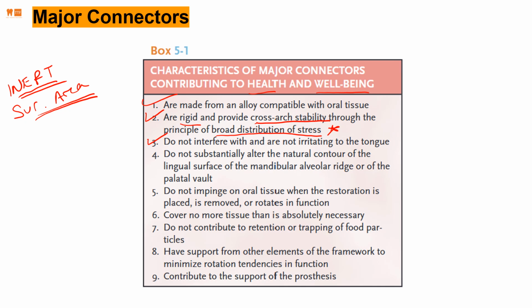Does not interfere with and are not irritating to the tongue. So, not irritant. Do not substantially alter the natural contour of the lingual surface of the mandibular alveolar ridge or the palatal vault. So again, inert. It keeps coming back.